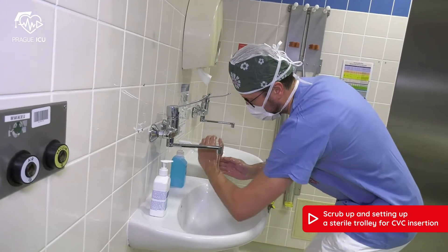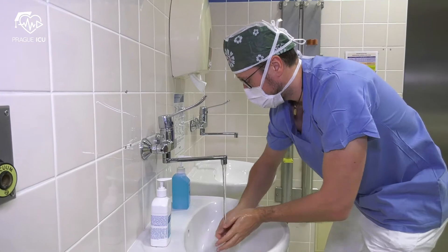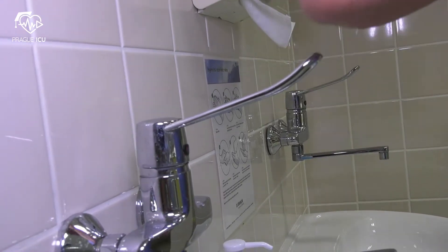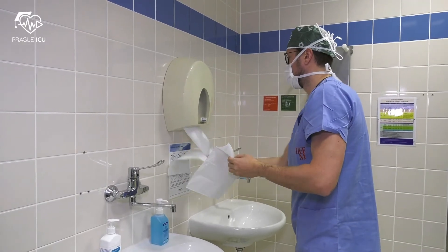Rinse well with running water. Wipe dry with a disposable towel.